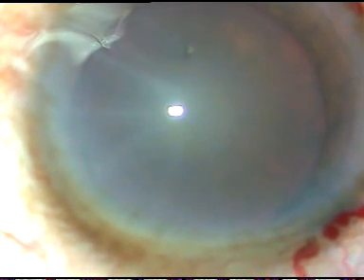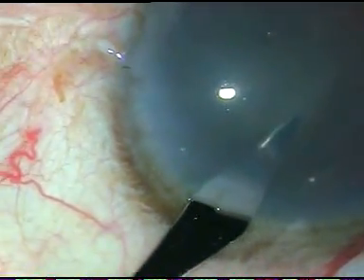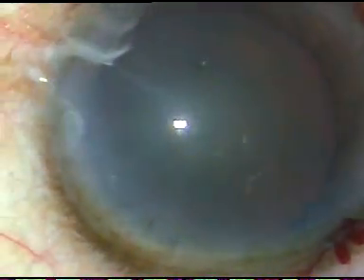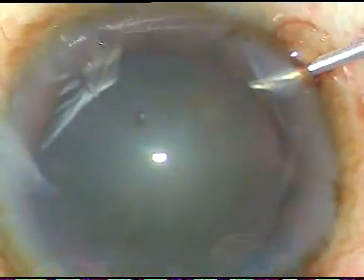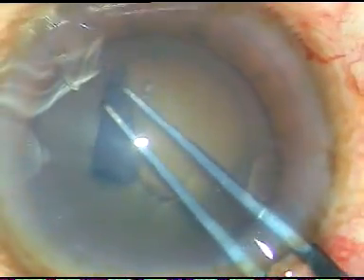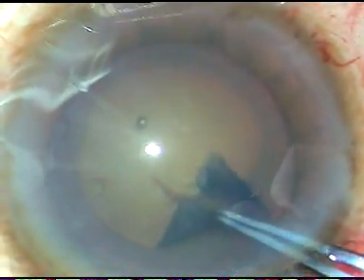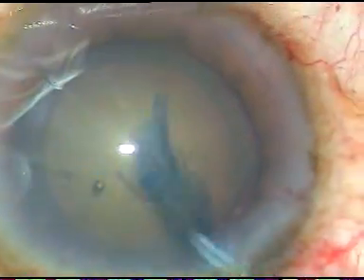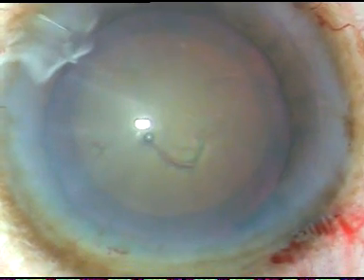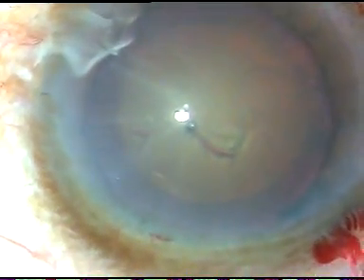HPMC has been injected into the anterior chamber and now one more paracentesis incision is made on the left side of the main incision. Now capsulorhexis is done. The anterior capsule is incised with a 26 gauge bent cystitome and a nice flap is raised. This flap is held with a Utrata forceps and with anti-clockwise movement I complete the capsulorhexis. The Utrata forceps rests against the anterior lip of the main incision so that leakage of HPMC becomes minimal.